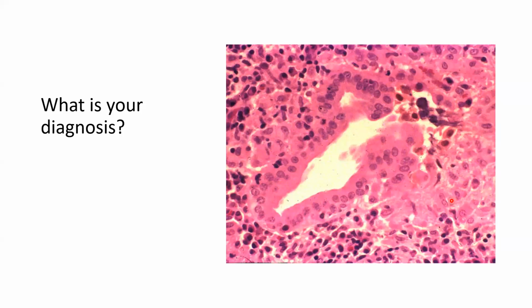This is primary biliary cirrhosis, right? Why? We said the presence of granulomatous inflammation, which are these macrophages with big cytoplasm and elongated nuclei. One of the multinucleated giant cells is attacking the bile duct and causing partial destruction. The bile duct is not complete, not a good normal bile duct; there is destruction in areas, here and here. Okay, so this is primary biliary cirrhosis.